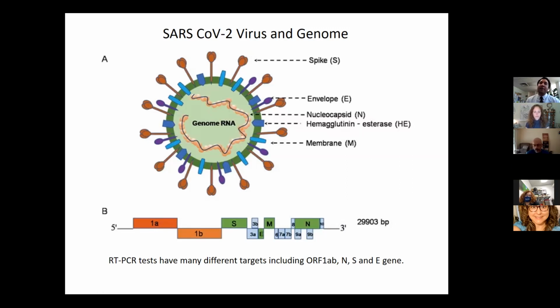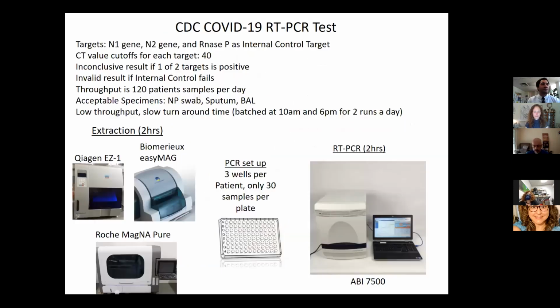If I targeted an area of that viral genome that, let's say, looked a whole lot like the flu. So in that RNA genome segment, the flu and coronavirus are very similar. If I target that by my experiment, then ultimately I won't know if it's the difference between flu and something like COVID-19. So you look for areas of the genome that are specific to SARS-CoV-2.